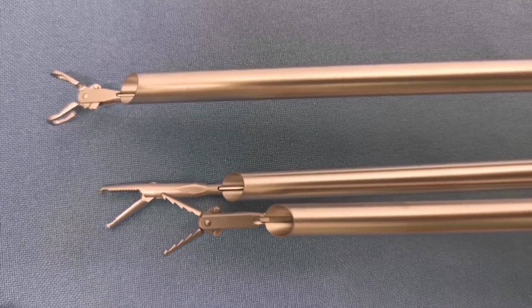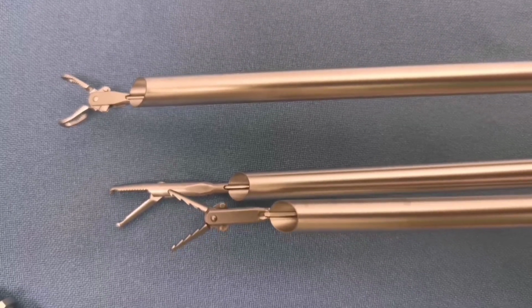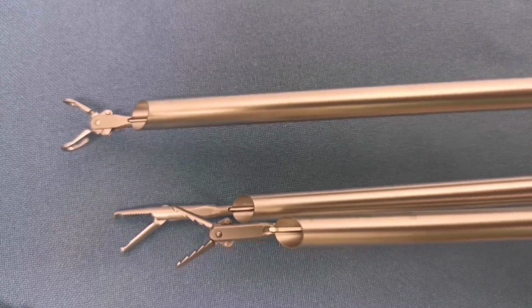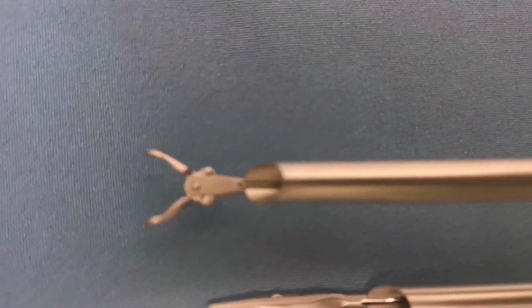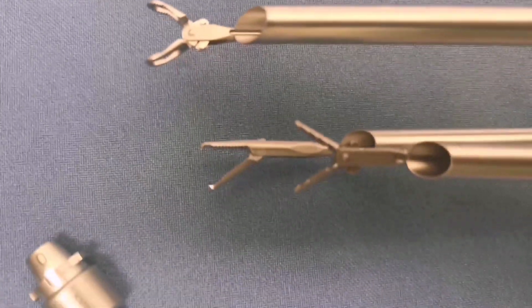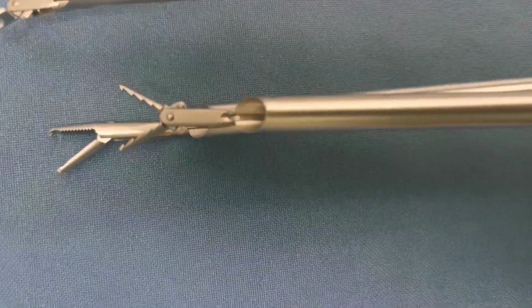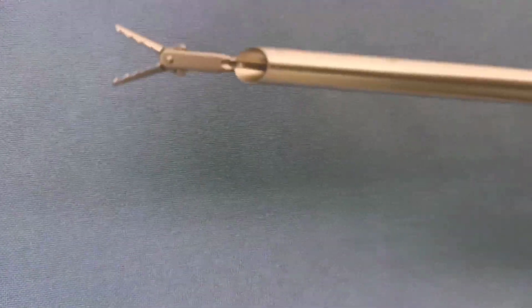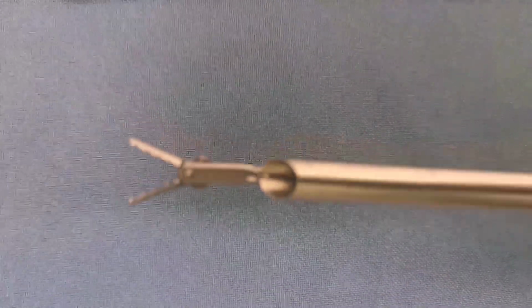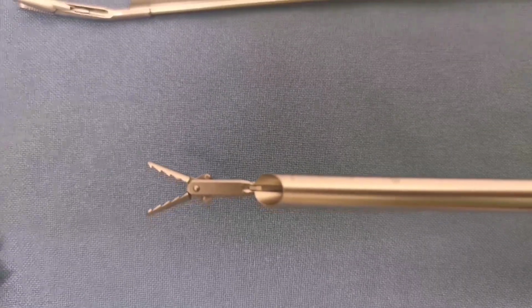For the optical forceps options in the foreign body kit, we have 3 forceps. The first one, this is a peanut forceps. The second one would be the alligator forceps. The third one would be the stent forceps. It's more serrated, which can grab stents more efficiently.